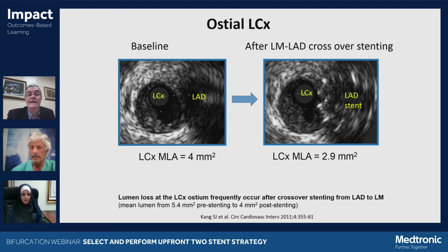I think it's great. There are several questions on POT and KISS, POT, KISS, POT. When would you decide to use the standard approach, POT, then kissing, and then final POT? And when would you elect to do POT, side branch balloon inflation, and re-POT proximally? Is there a difference in your practice, POT, KISS, POT versus POT, side branch inflation, POT?